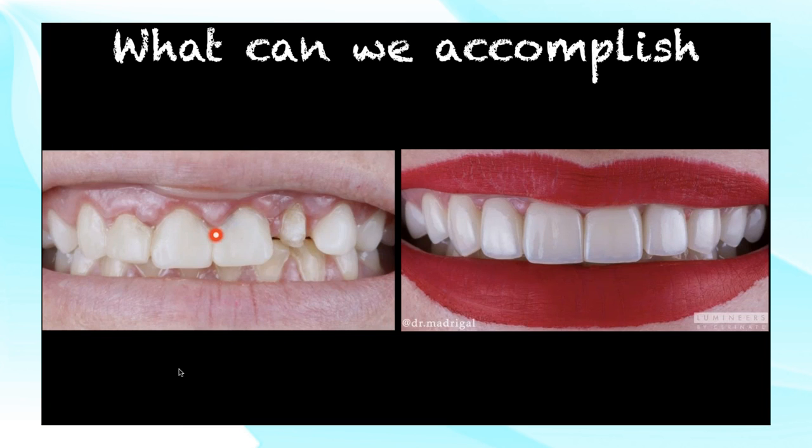This case was done with our technique as well, but unfortunately, the teeth were reduced so much already that there's really not much we could reduce. So we didn't reduce anything anymore. We did do a little bit of a gingivectomy with that trial smile, and we were able to accomplish something like this. So this is the smile that we got for the same patient in just a few weeks.